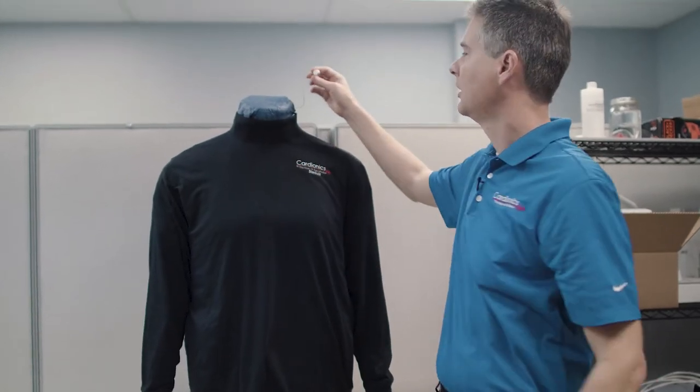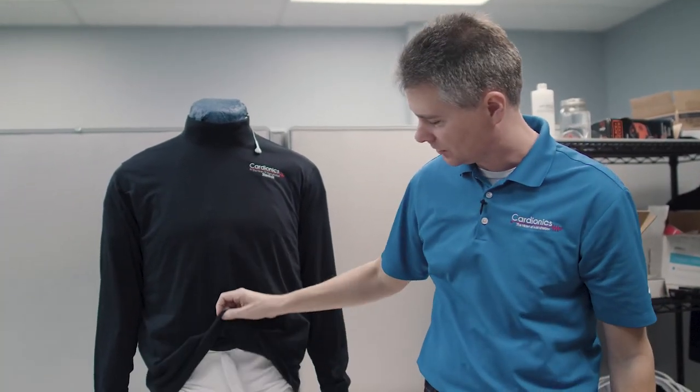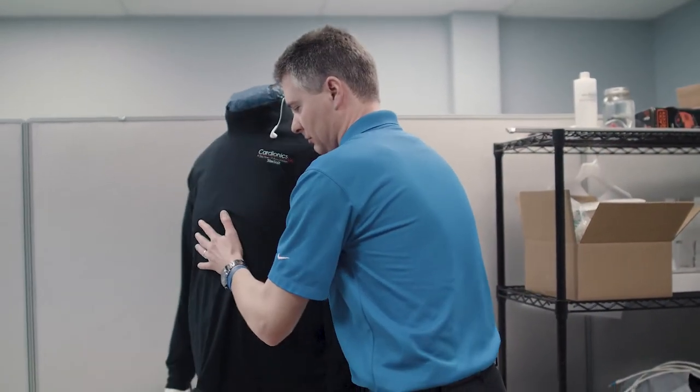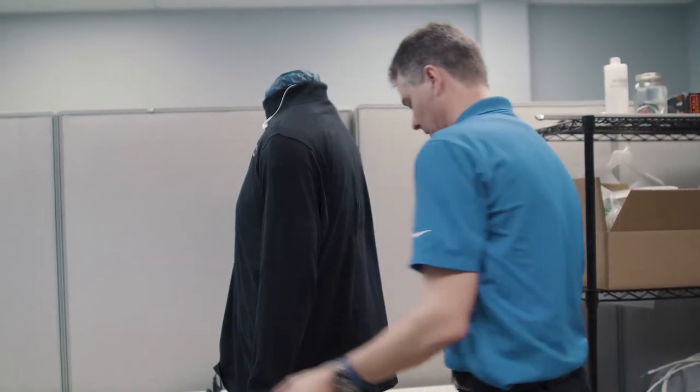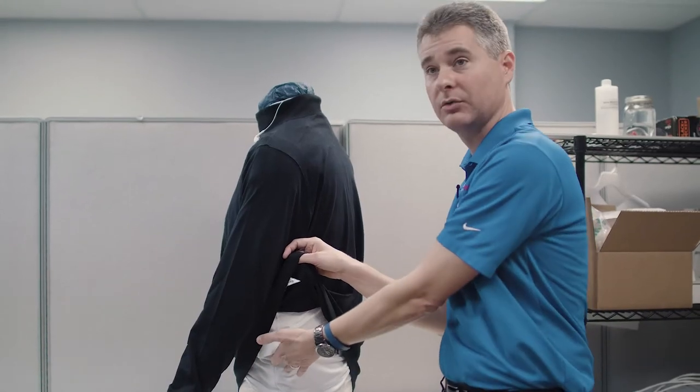The shirt also covers up some of the cabling — here's the earpiece so that you can get cues from the instructor. There are three places that you can place the control monitor, or the tech pack as we call it: there's a place in the back and hooks on both the right and left sides.